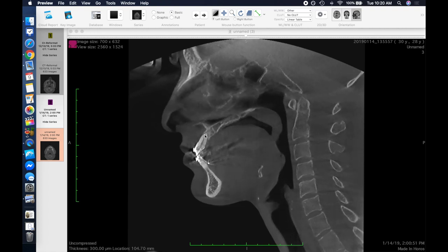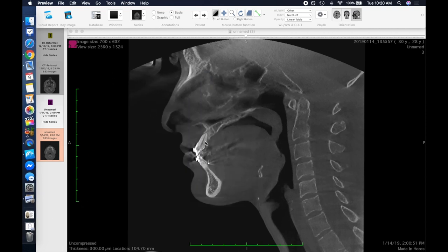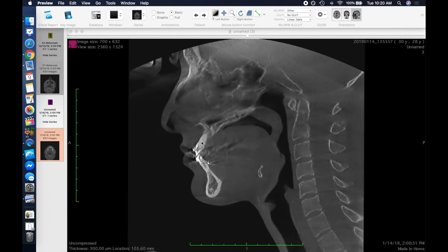Let's proceed to tooth number 9. Now, if you remember, tooth number 9 on the last x-ray had a robust amount of alveolar bone coming all the way down the root on the front side. Here we see barely any alveolar bone, and it's all the way at the tip of the root. And coming down the front of the root, there's nothing. No bone on the front of the root of the tooth. So there, you see drastic amounts of change from before AGGA and after AGGA in controlled arch braces.